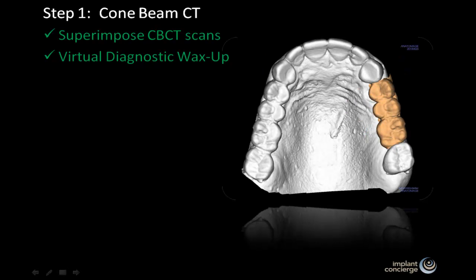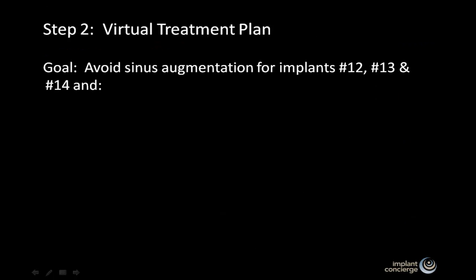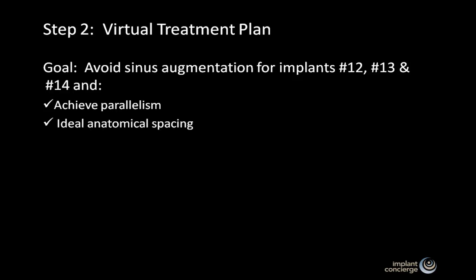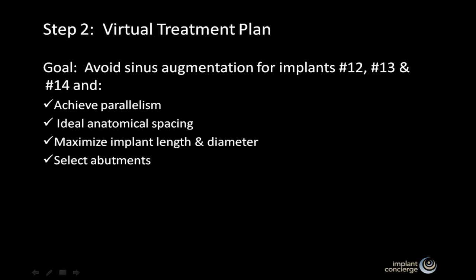A virtual diagnostic wax-up is created for a stunning 3D image. Here is an occlusal view of the virtual diagnostic wax-up. It's now time to finalize the ideal virtual treatment plan. ImageDent provides all software and expertise necessary for this online meeting. In this case, Dr. Lorenzana's goal was to avoid a sinus augmentation procedure and place three implants in positions number 12, 13, and 14 while achieving parallelism, anatomical spacing, and maximizing the implant length and diameter. Since a virtual diagnostic wax-up has been created, the abutments can also be selected during this online meeting.